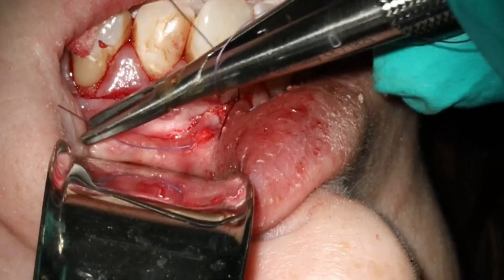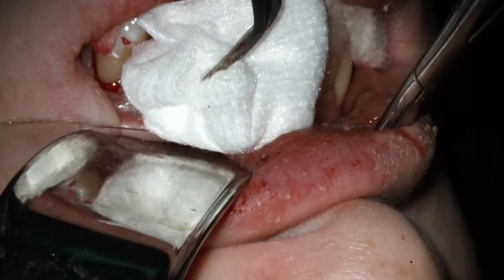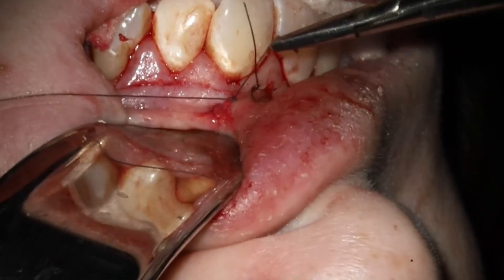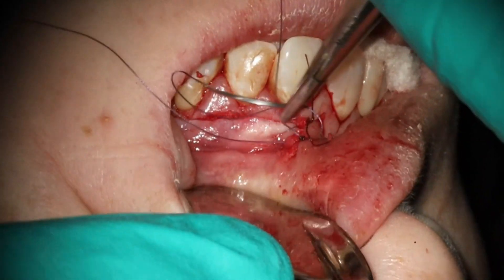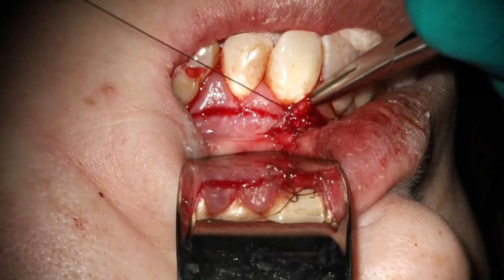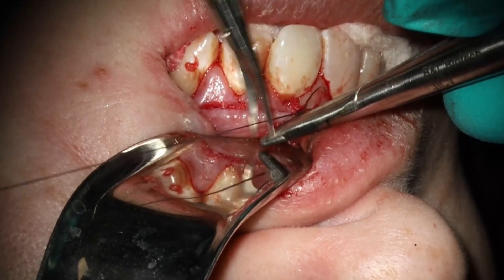The vertical is a normal running locking, just like you've seen me do many times — totally fine. But along that horizontal cut, right where the papillary sparing incision is, I want to try to get this to hold as tightly as possible, because she already had recession here. Nice young gal unfortunately just has some perio, which is very strange — her teeth are clean and she's got really nice thick gingival. I found that if you're right on top of the frenum and almost involve it in the suturing, it can't move as much. So you run less risk of it ripping everything out. The vertical is pretty boring — it's a normal one — but the horizontal is where things get interesting.